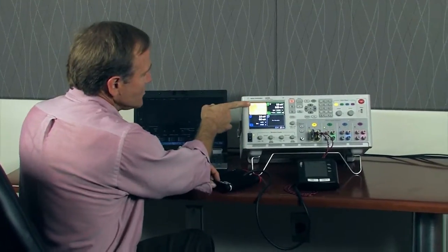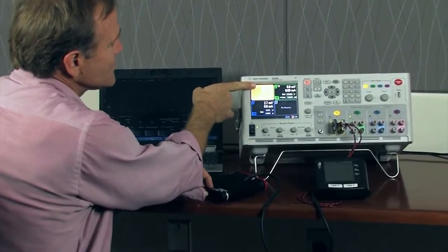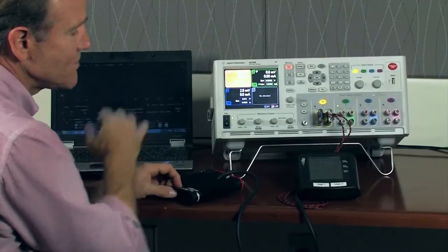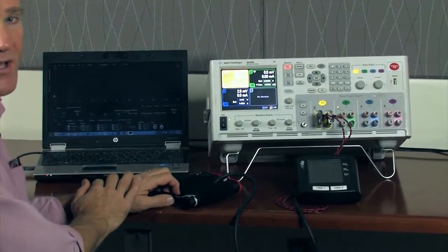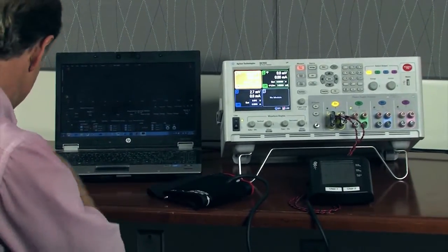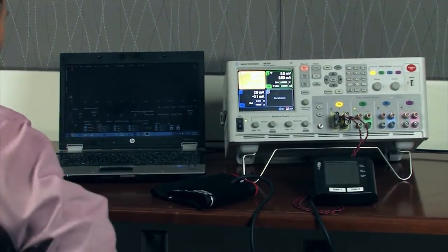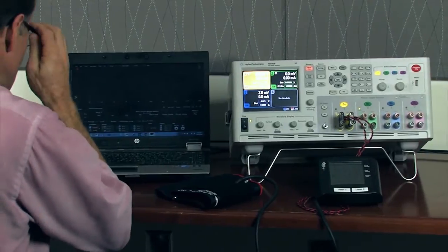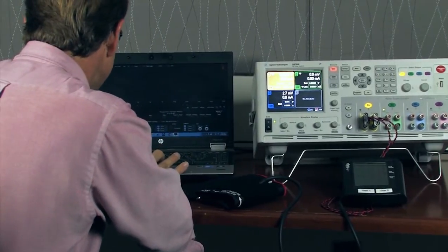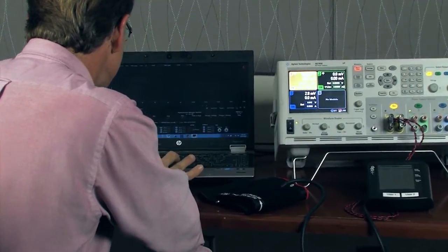As you look at the SMU, it's at 6 volts so we're simulating the battery in our medical device. I'm going to go ahead and start the data logger and we're going to log for 5 minutes.